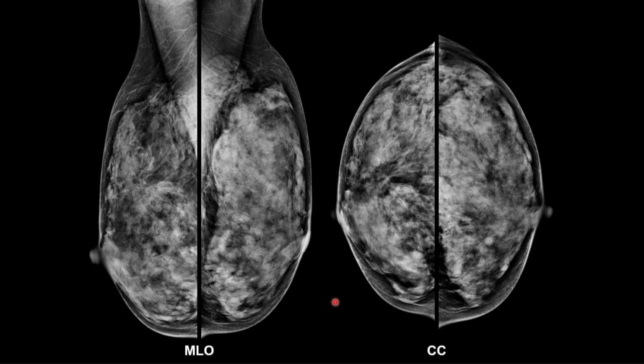Yeah. I just want to make a comment. Most of the time when we're screening breasts, we already go with tomosynthesis. And with tomosynthesis, we rule out. Yes, exactly. If you have tomosynthesis and the patient has agreed to have it done, we try to do it on all of our patients, but some of the patients don't want it, so we don't do it.